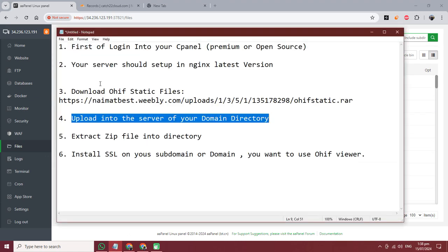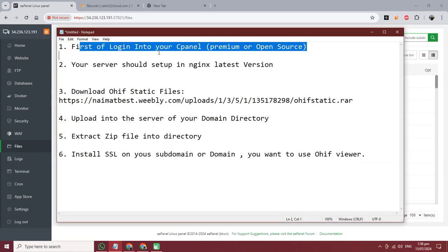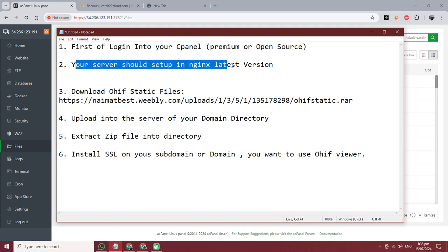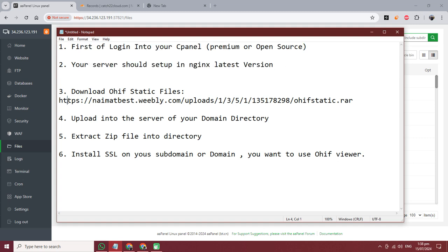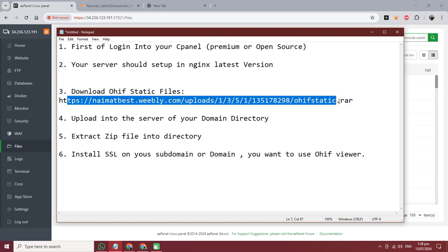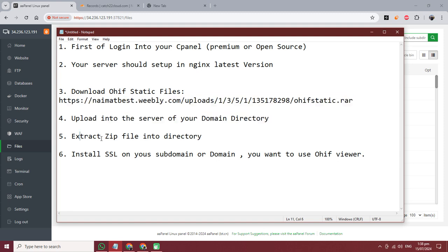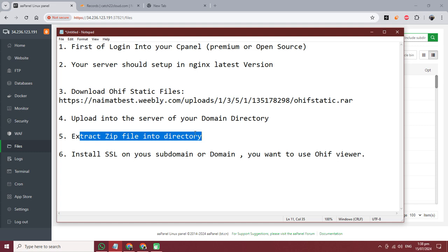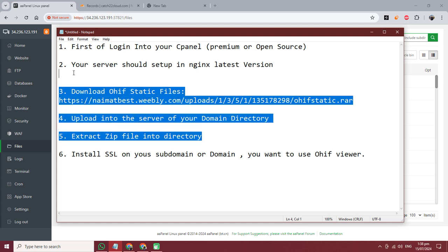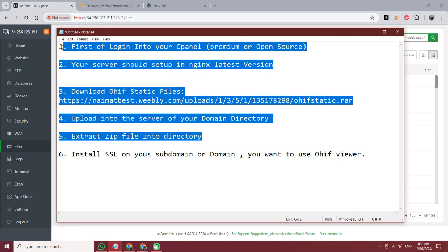First, log into your control panel. Your server should be set up in nginx. After that, download the static files of OHIF, upload to the directory, and extract the zip file into the directory. We have already followed all five of these steps.